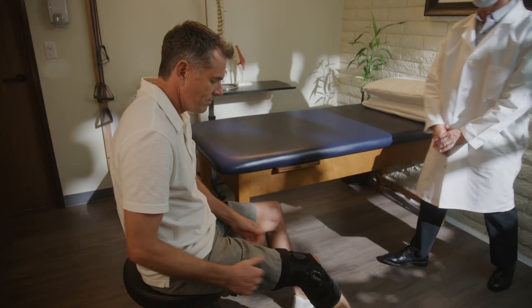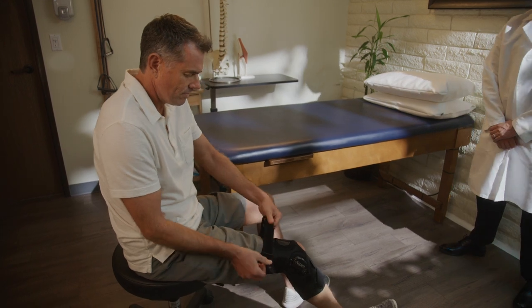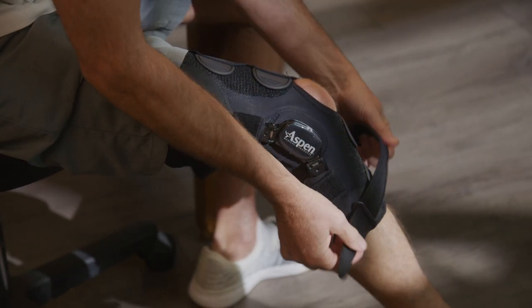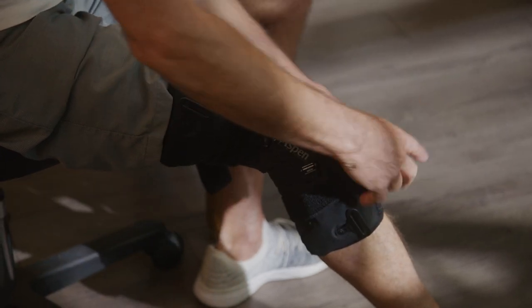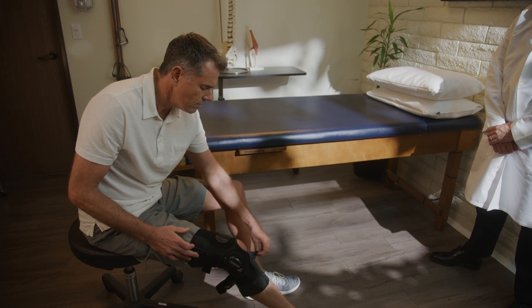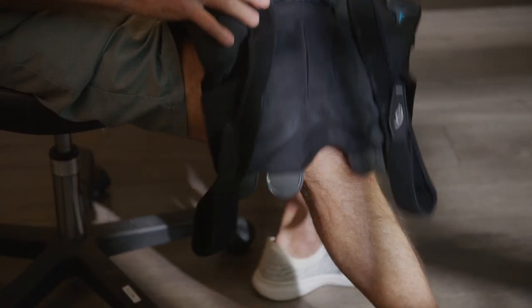The patient must be sitting down to properly remove the brace. Loosen and remove the upper thigh and calf straps, then remove the tabs and take off the brace.